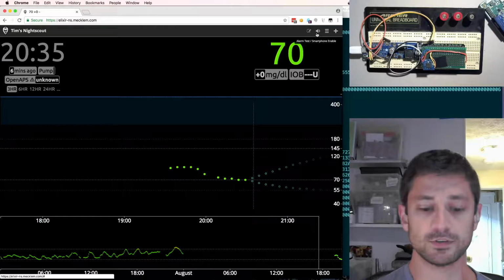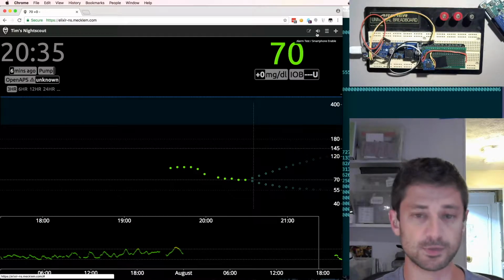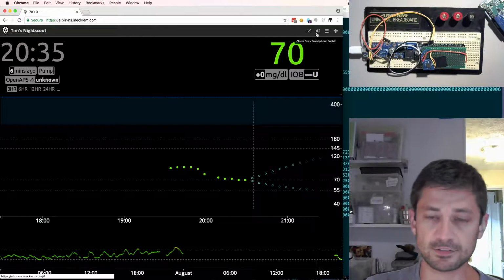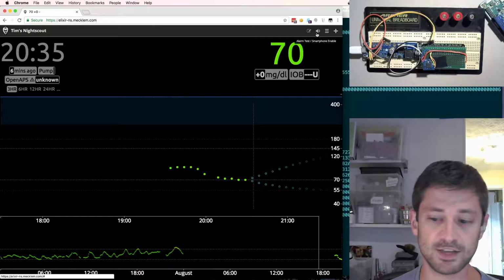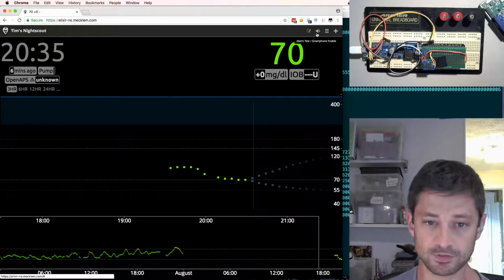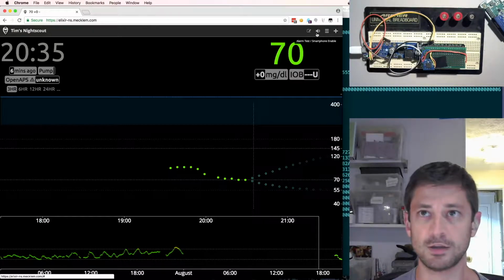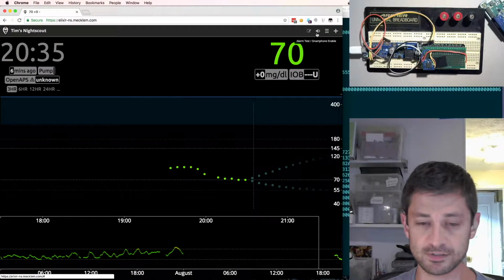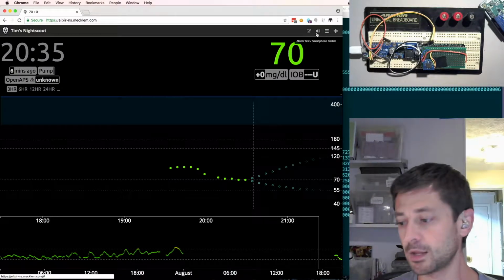If for some reason it is unable to set the system time, it kind of freaks out because it thinks that it's 1969. And then every 5 minutes, it goes and it says, hey, pump, give me the last 20 minutes of data, but it uses 20 minutes offset from the epoch, which is not ideal. So it just fetches as many pages as it's willing to fetch, and eventually it gives up because it's in a different decade than we are.